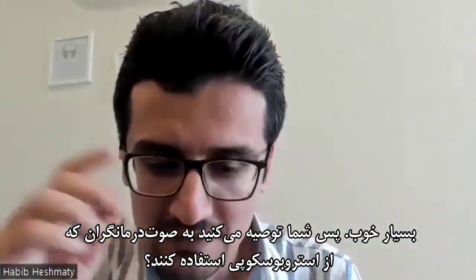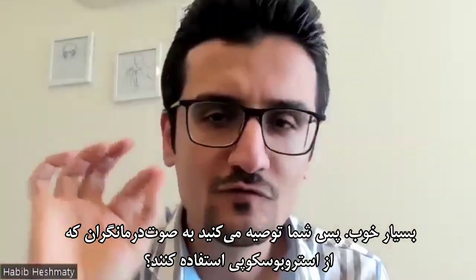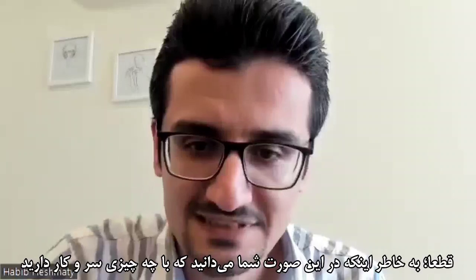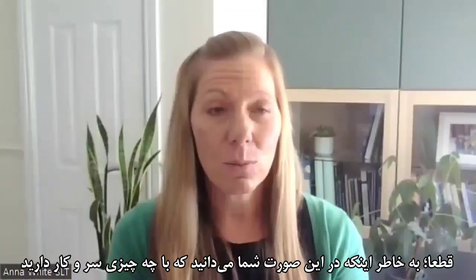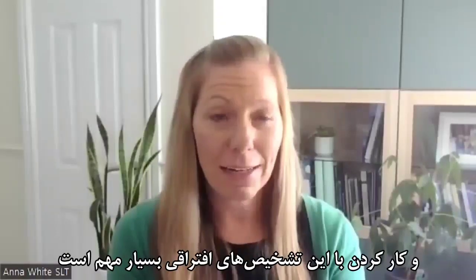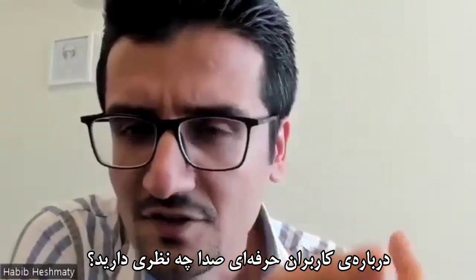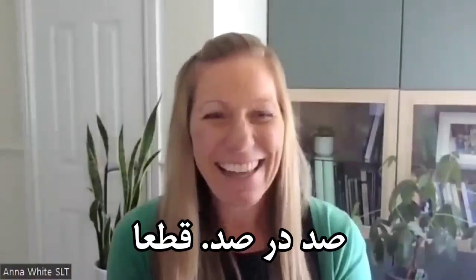So you recommend stroboscopy in voice therapy? Absolutely, because then you know what it is that you're dealing with, and working out that differential diagnosis is so important. What about professional voice users? 100%, absolutely.